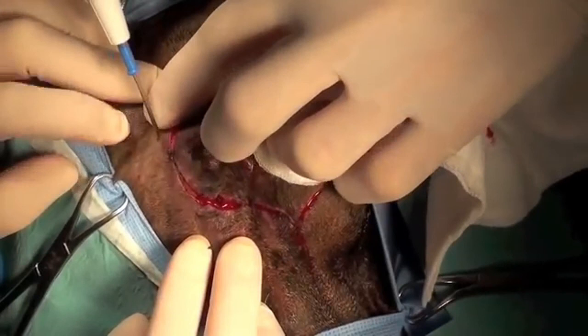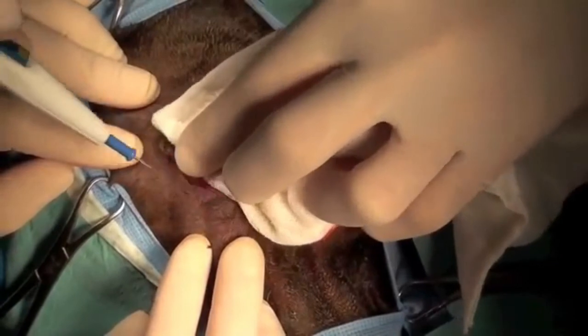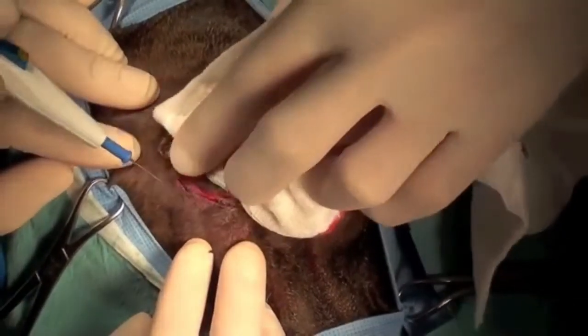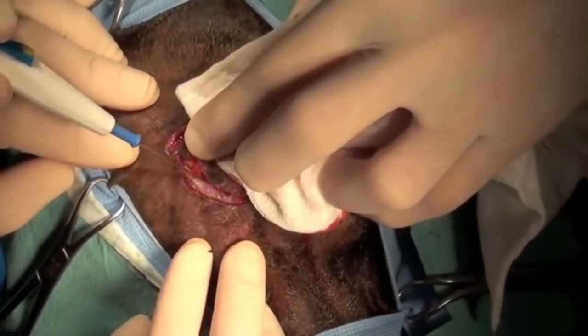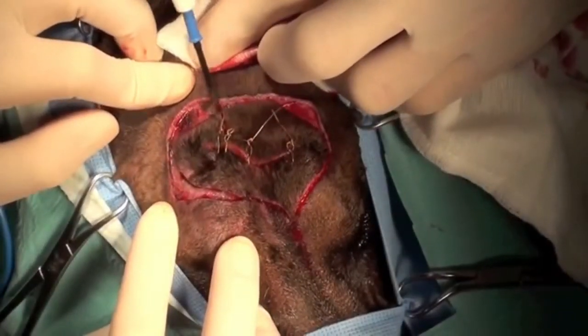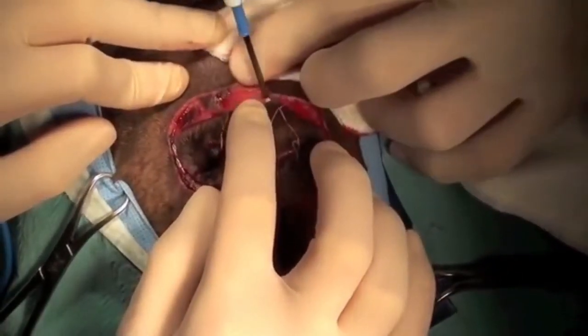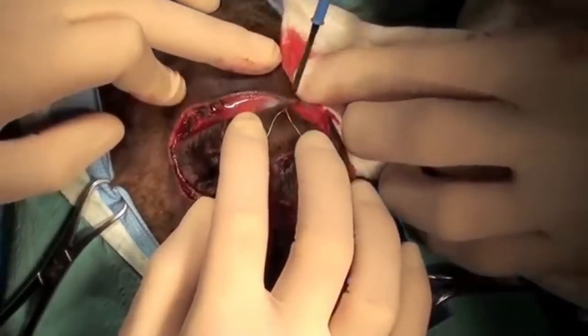Okay, there's another one. This is when you use a cautery to make your incision as compared to a scalpel. Now at this point we're excising the previous biopsy tract in order to prevent tumor seeding from the previous biopsy.